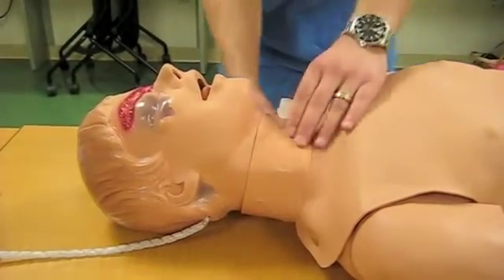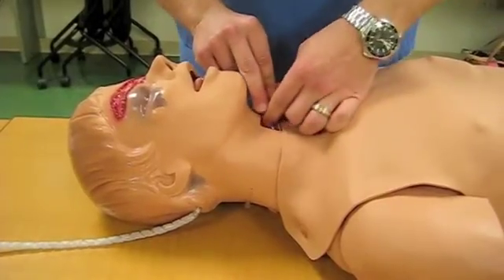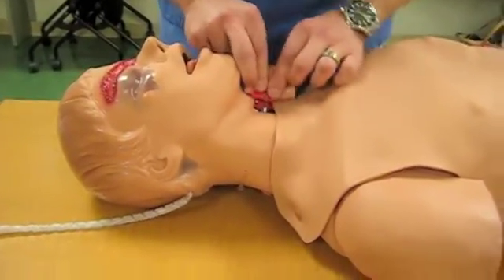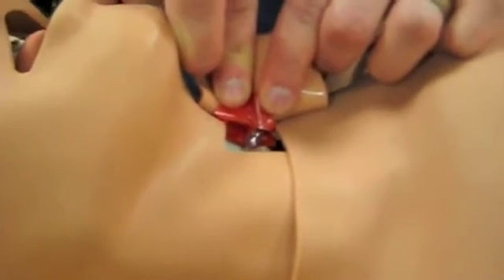To confirm, you can either use the bag, but with the cricothyroid simulator, you can see that the tube is through the cricothyroid membrane and into the trachea, confirming placement.